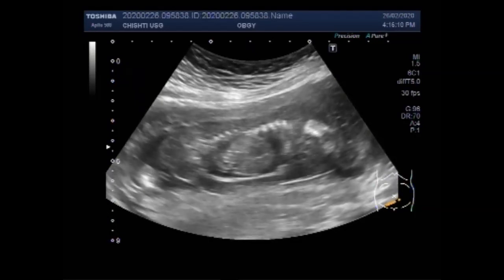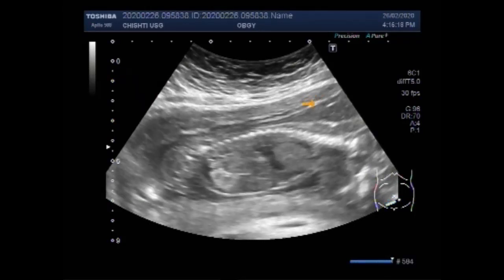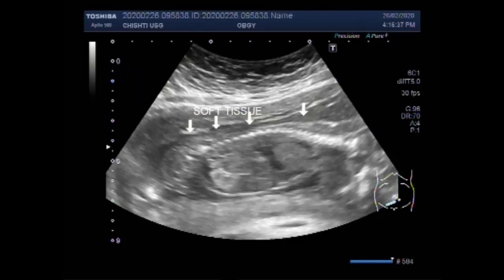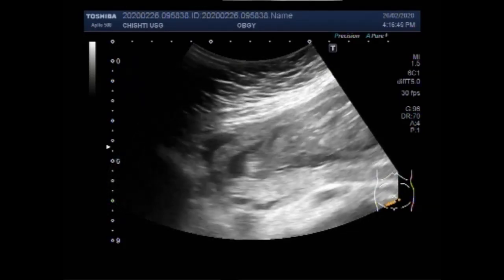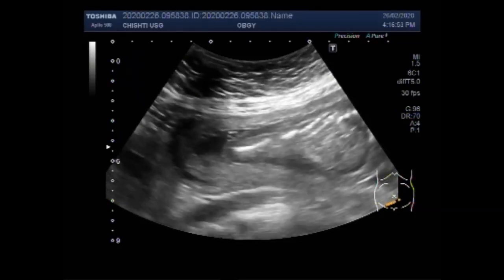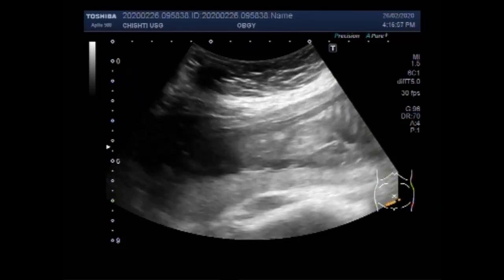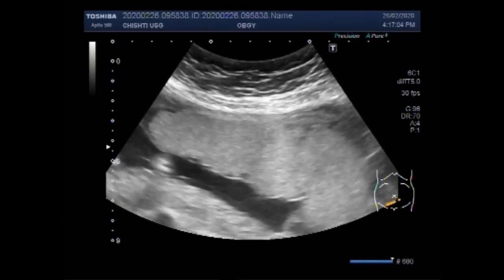You can see the femur, but the distal portion of the lower limb is missing. Both upper limbs are totally missing, and soft tissue edema is present. An image is seen along the whole length of the fetus including the fetal head. The femur is visible with a small foot attached; the tibia and fibula are missing. This is the placenta — a large placenta.